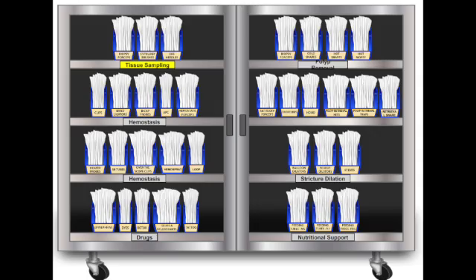Got it. Okay, so the area is stable. We can see clearly. Let's talk about the spray catheter. This is about applying dyes, right? Painting the inside to find problems. Precisely. It's like using contrast to make things stand out. And the key here is knowing which dye to use for what potential issue. So it's specific. Very specific. If the doctor's screening the esophagus looking for squamous cell cancer, you'll be reaching for Lugol's iodine. It stains normal tissue brown, but abnormal areas don't take up the stain, they stand out.